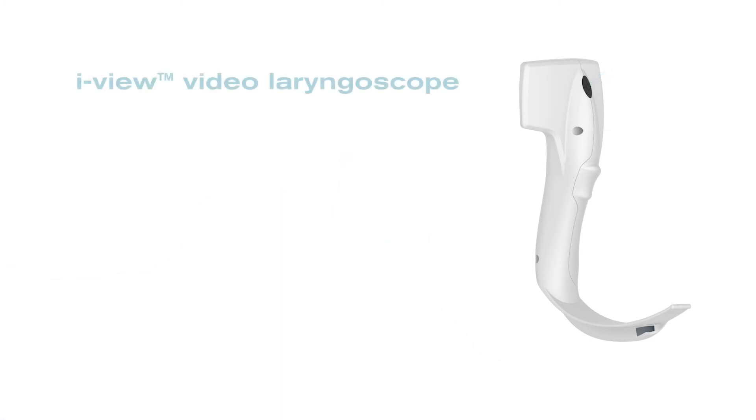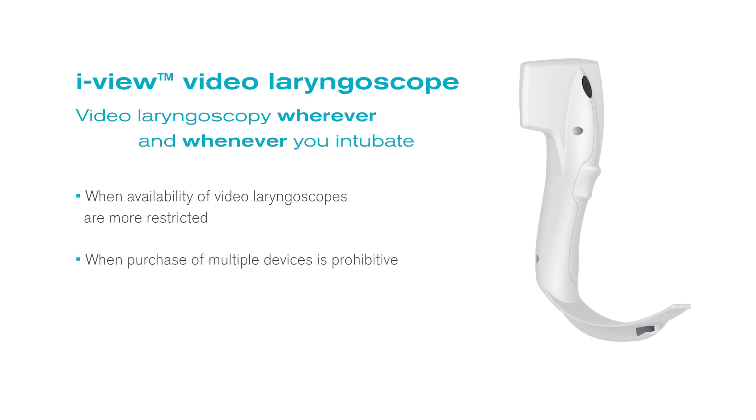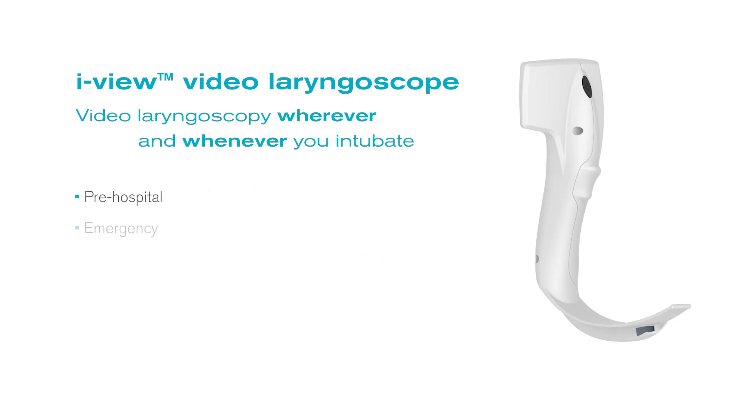As iView is single use and fully disposable, it provides the opportunity for video laryngoscopy wherever and whenever you intubate. It is ideal for use where the availability of video laryngoscopes may be more restricted or purchase of multiple devices prohibitive, such as in pre-hospital, the emergency department, intensive care, or maternity.